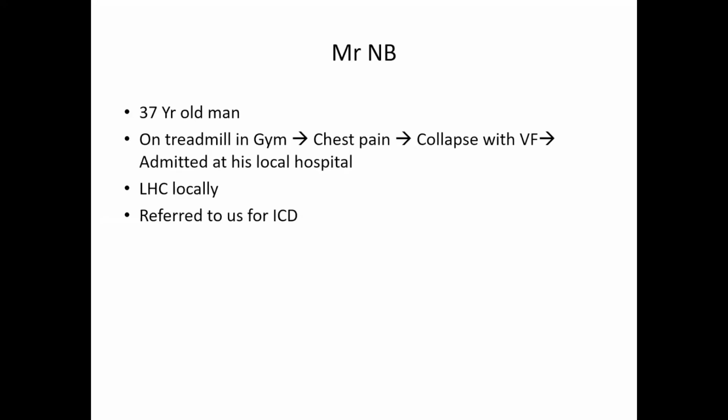Okay, so we'll just quickly go through some of the cases. We don't have to go through all the cases, but we'll see how much we can cover.